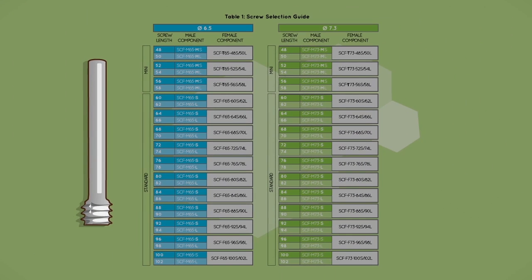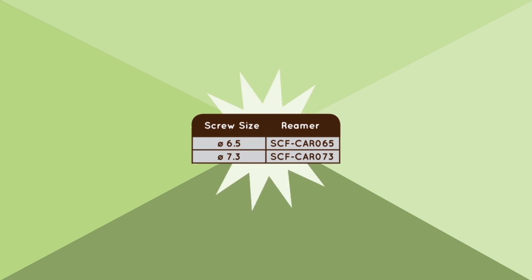Step 4, Reaming: Using the reamer corresponding to the desired screw size, ream up to but not through the growth plate.